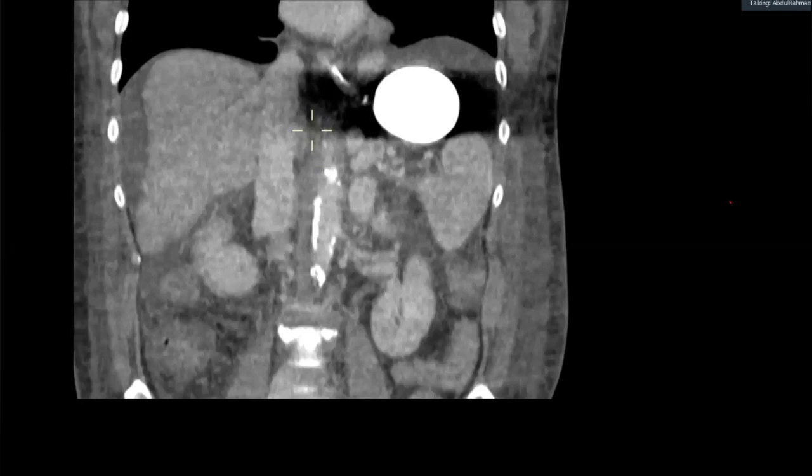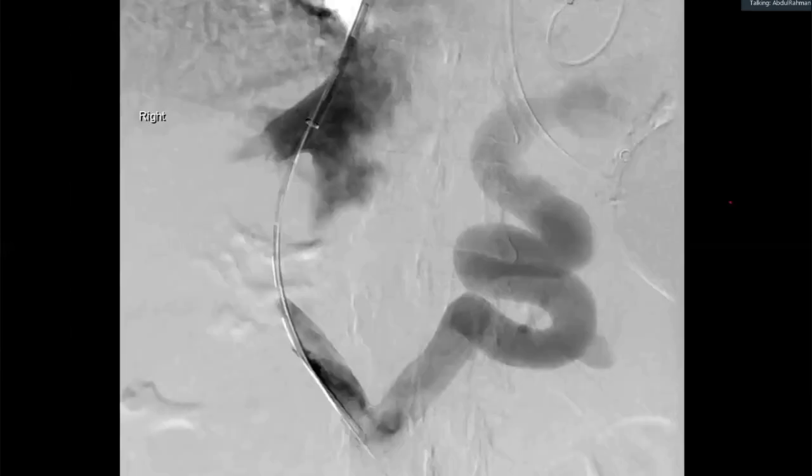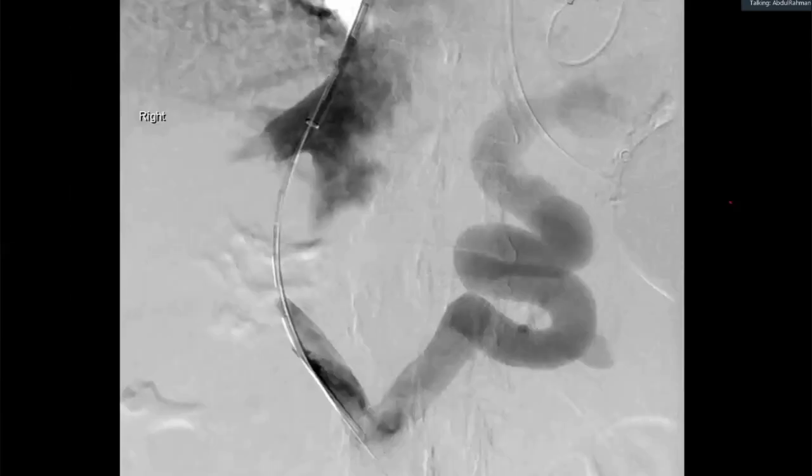Okay, so this is a gastric balloon. This patient had a Sengstaken-Blakemore tube inserted and was transferred from another hospital to our hospital. I was doing my fellowship during this time. The treatment of somebody with bleeding varices, once they've failed endoscopic treatment, is inevitably to have a TIPS procedure, okay? So this patient is in the midst of having a TIPS procedure through the transjugular approach.